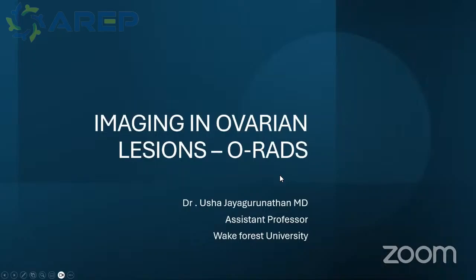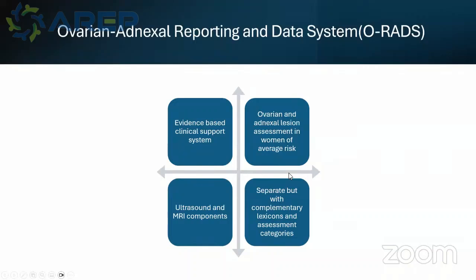Good morning, everyone, and good evening as well. So today we'll be talking about imaging in ovarian lesions with focusing on O-RADS. The Ovarian-Adnexal Reporting and Data System is an evidence-based clinical support system which was published by the American College of Radiology. It has both ultrasound and MRI components.